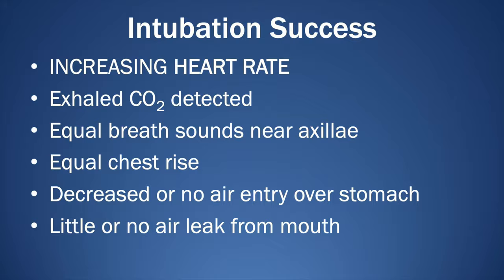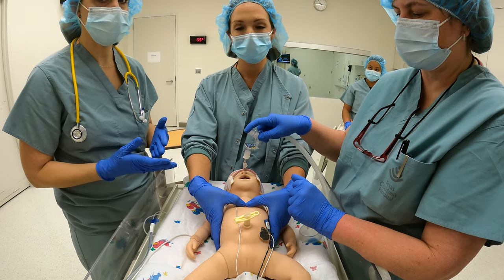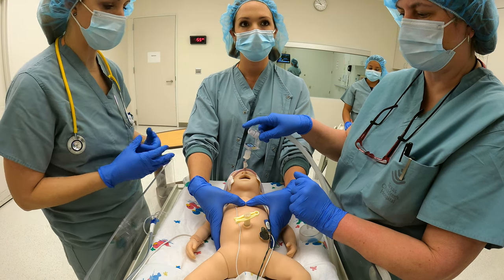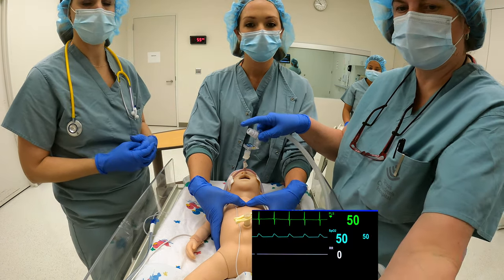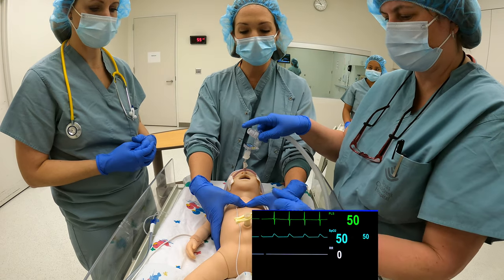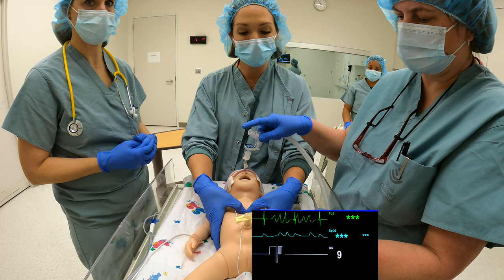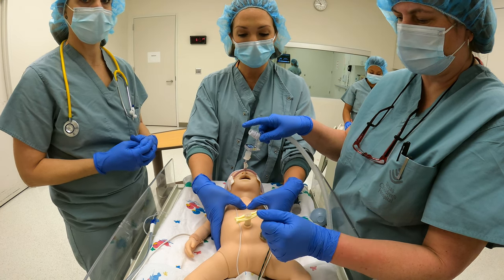Okay, the heart rate is not above 60, and I'm sure we are intubated and giving effective ventilation. Corey, please start chest compressions. I'm going to 100%. Starting chest compressions at a 3-to-1 ratio. 1 and 2 and 3 and breathe. 1 and 2 and 3 and breathe. 1 and 2 and 3, breathe.